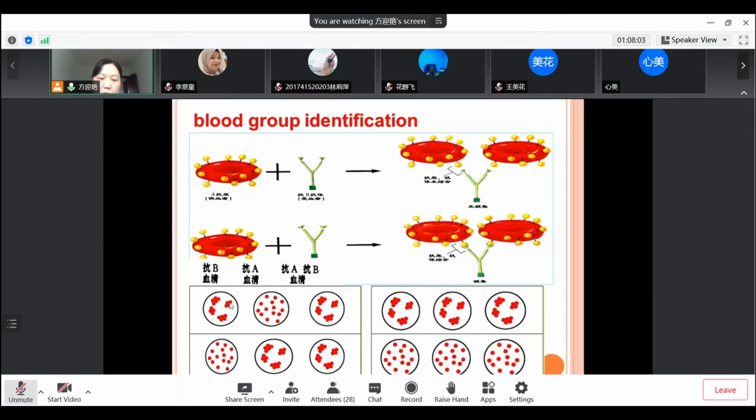There are many red blood cells, but basically the antibodies bridge them and lead to red blood cell aggregation. The aggregation can be very small or very large, and we can see it by eye. So here we have the anti-B antibody.